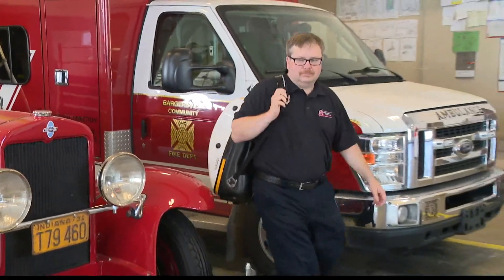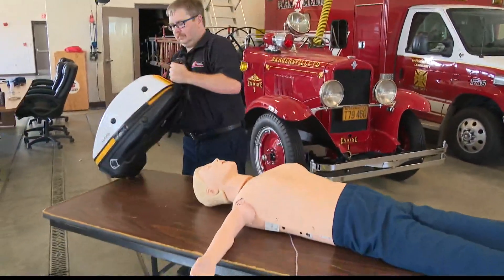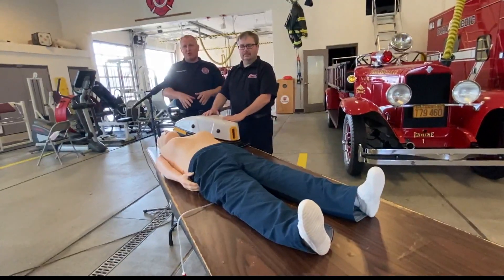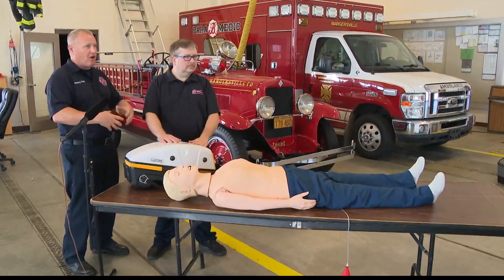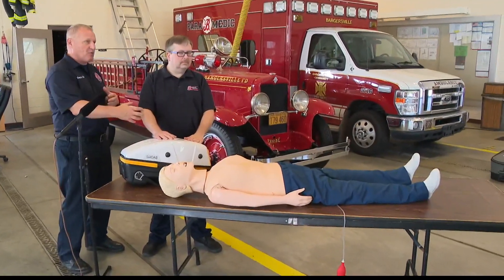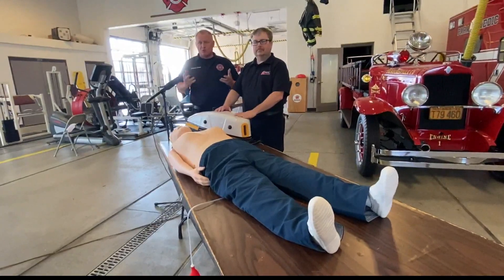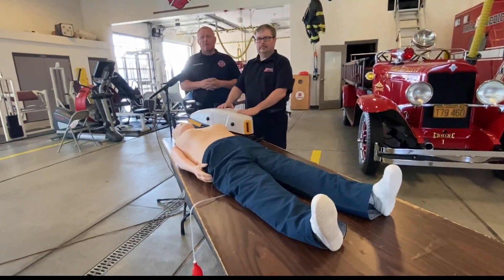This machine can help save lives while also social distancing. Being able to apply this machine and the quality CPR it provides allows us to take one person who would normally be doing the chest compressions and actually pull them away. So there's still care going on, but it's one less person that has to be right in the middle of that workspace, risking potential exposure. We wear PPE to reduce that in the first place, but this provides that option.